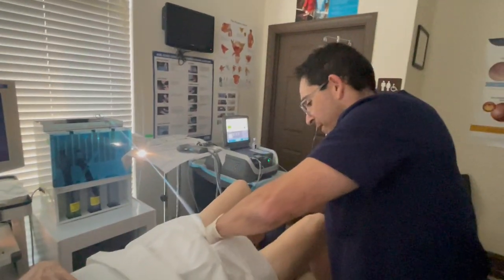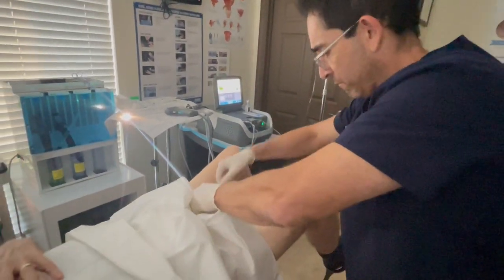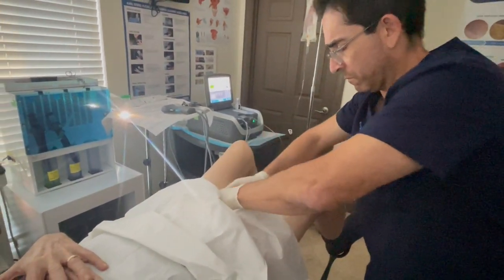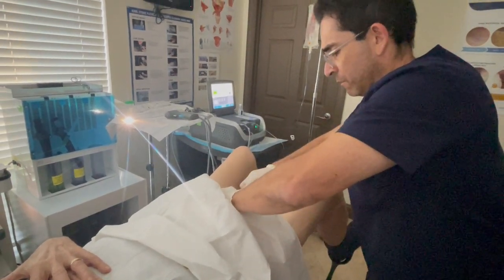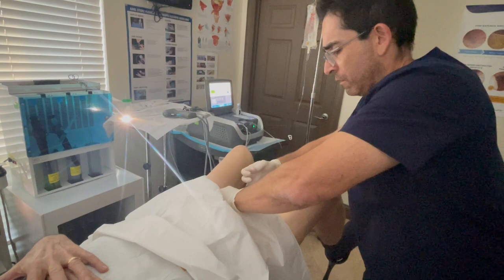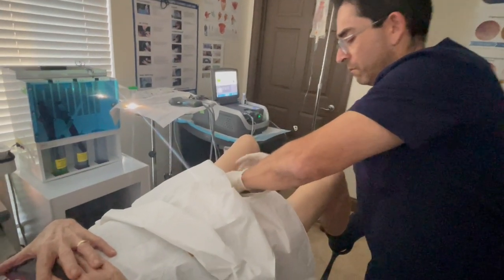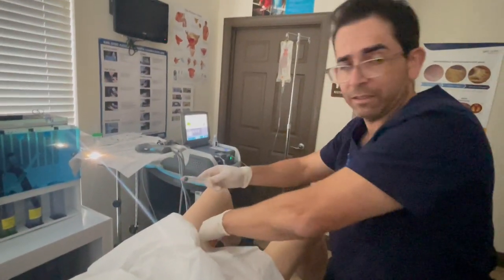He did great, our patient here today. Thank you. Actually, this joint's a little bloody, but it'll clear up. Why don't I get 10 more cc's?